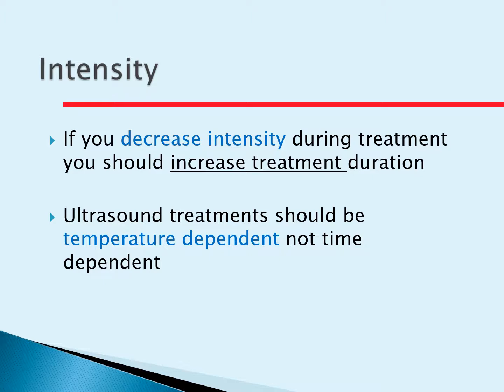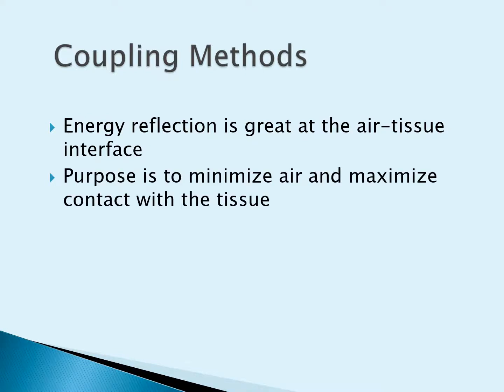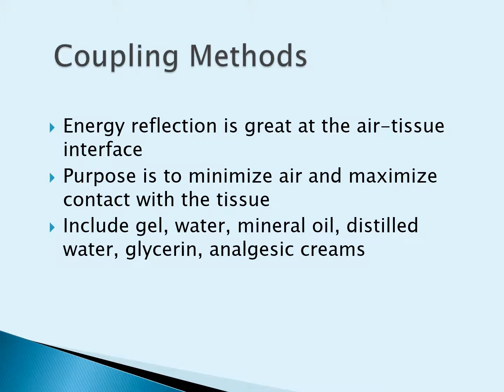Ultrasound treatment should be temperature dependent, not time dependent, meaning you want the whole tissue to warm up. We don't care as much about how long we treat for billing. Energy reflection is great at the air-tissue interface. That means we need to minimize air and maximize contact with the tissue, so we're going to use a coupling agent, which is typically gel, water, mineral oil, something to that effect.